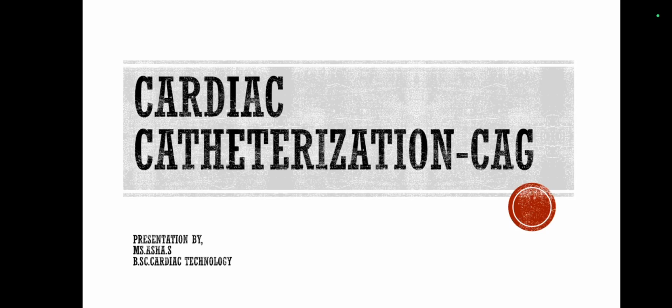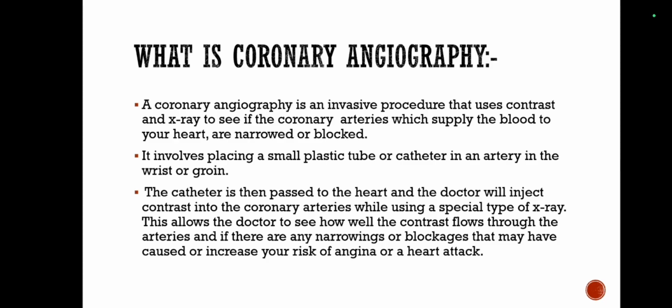Hello everyone. So today's presentation topic is cardiac catheterization CAG, which is coronary angiography procedure. So first of all, what is coronary angiography?